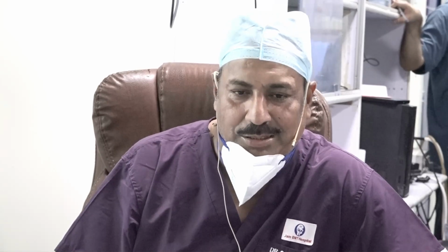So this is one of the functional aspects you can assess in the pre-operative assessment. And that's the surgical technique. I told you there is a middle ear cleft which needs to be addressed. It's not about mechanically repairing the tympanic membrane perforation. We need to look at the eustachian tube.